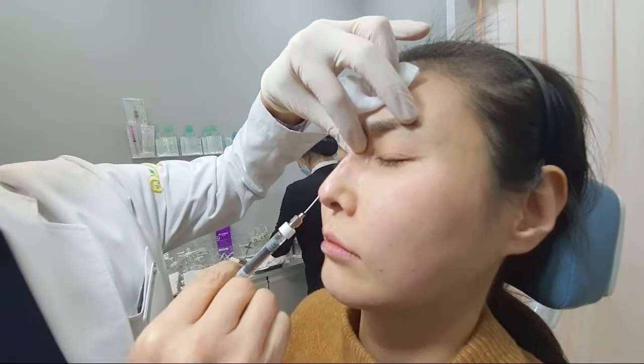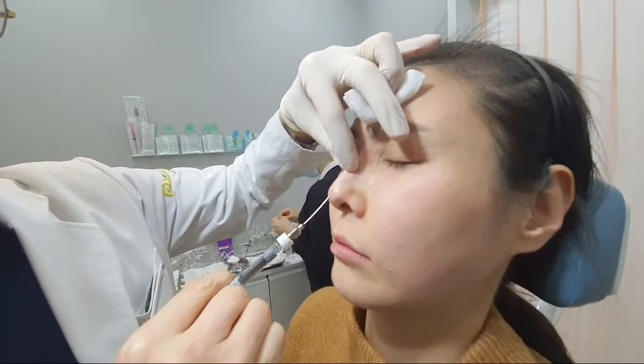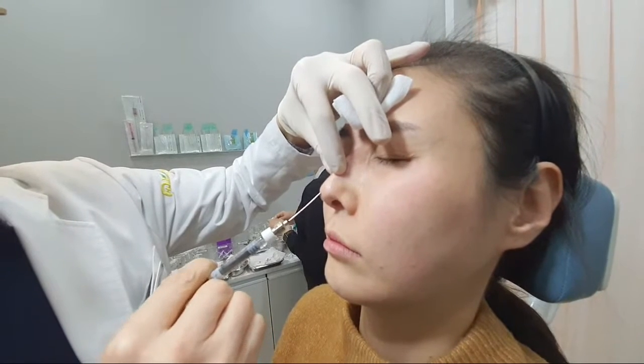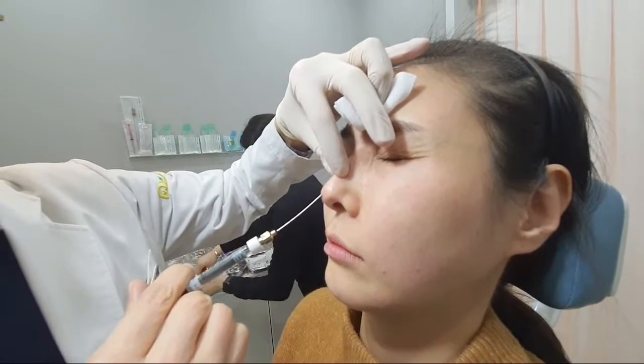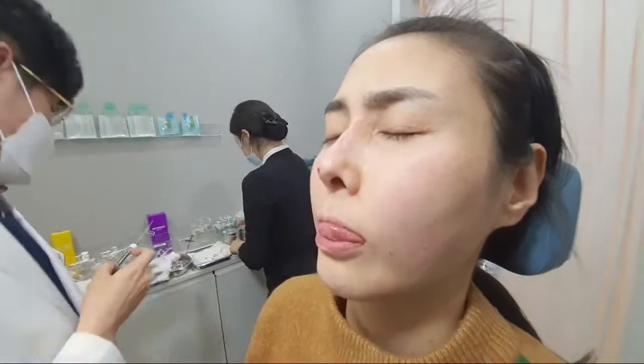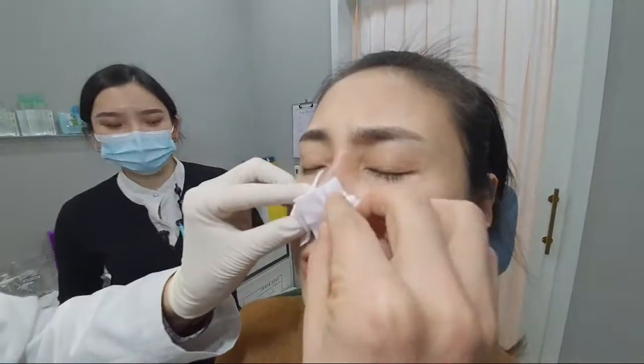So the area of injection at the moment is at the fat layer. The fat layer is not very painful, so it's best not to do the whole anesthesia. Just at the top of the tip of the nose is necessary.